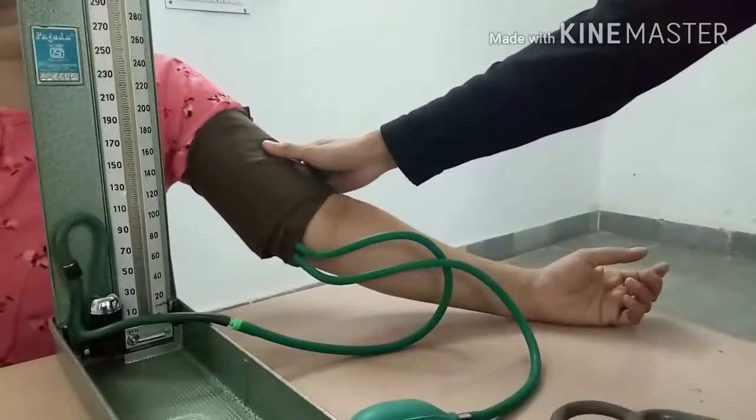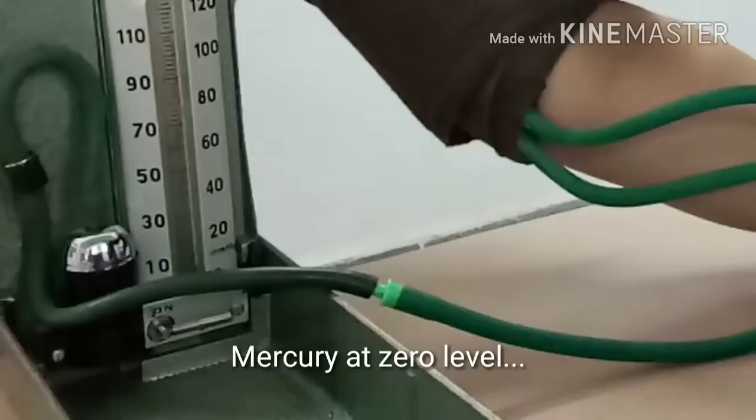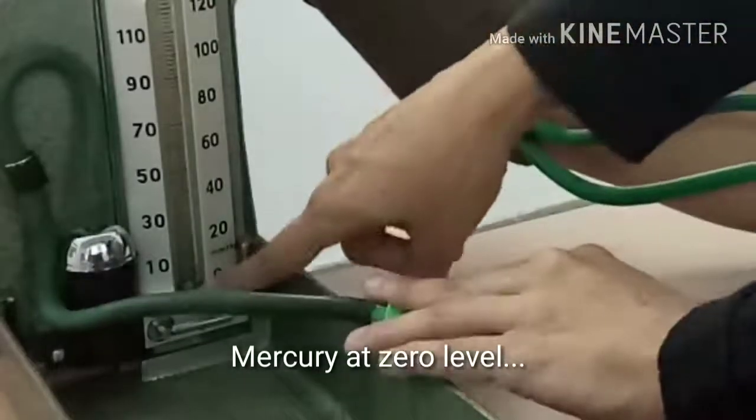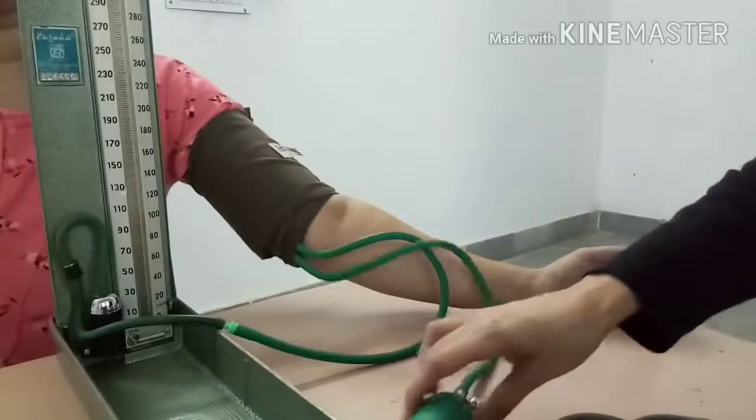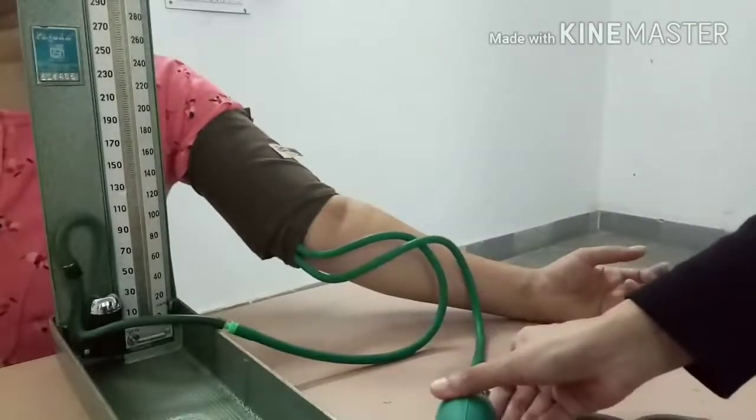The initial mercury mark must be at 0. Deflate the cuff between measurements to avoid venous congestion.